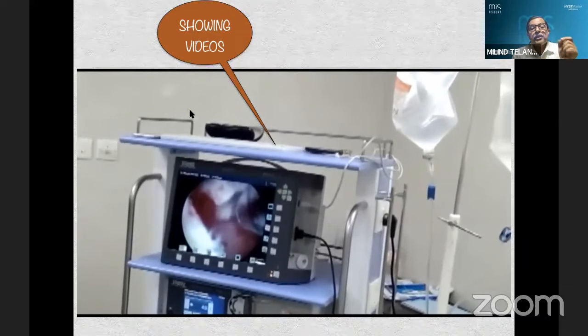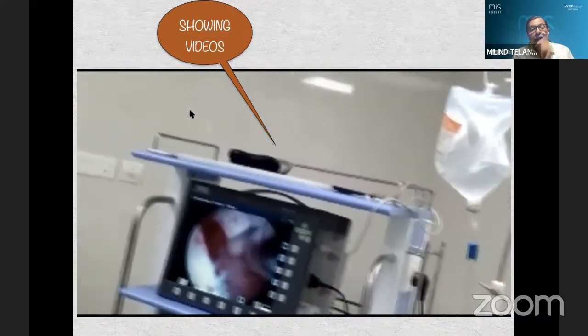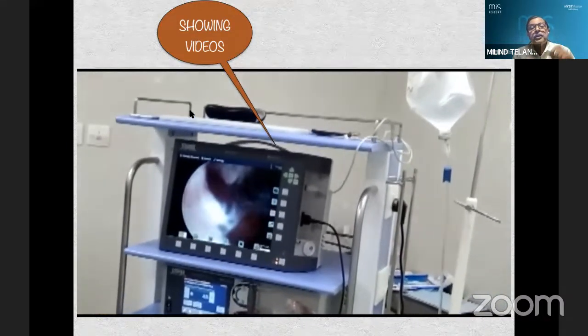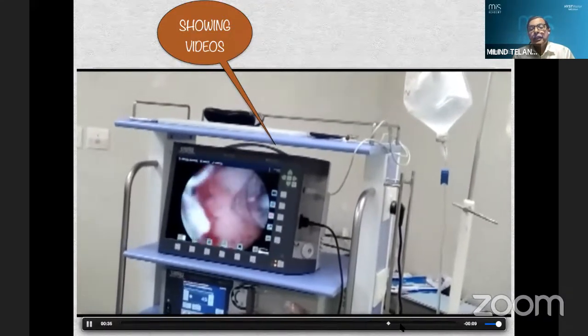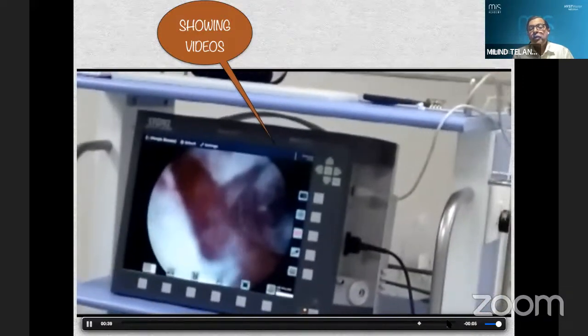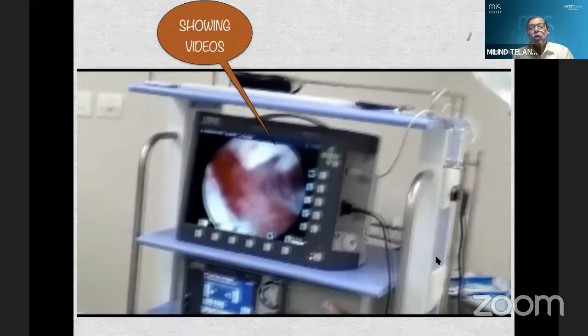So this is the best way of evidence-based medicine, that the patient has been diagnosed on sonography with a particular pathology. You're removing it under vision so that she knows that the entire pathology is removed completely. And this is recorded and kept. And here you can see the Easy Endomat, which you were previously using also. So this is the routine which we do for all our patients.